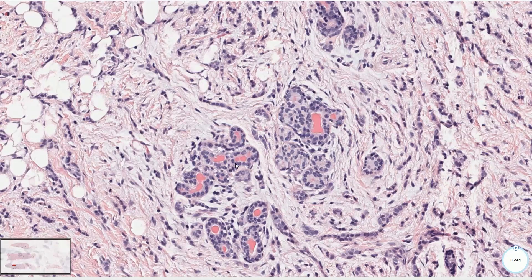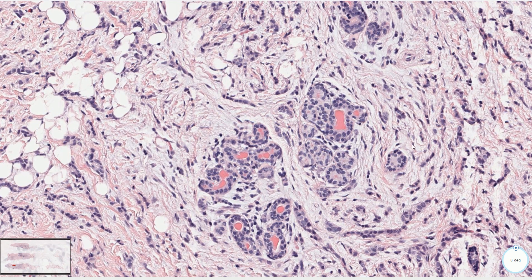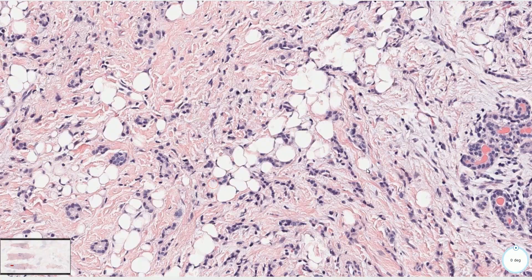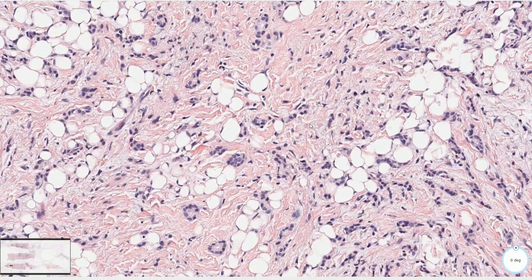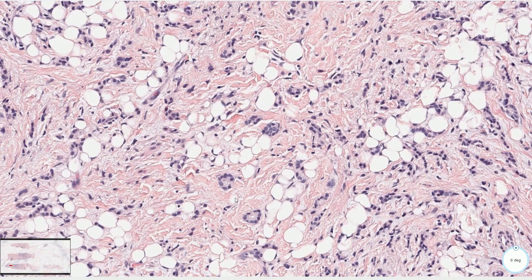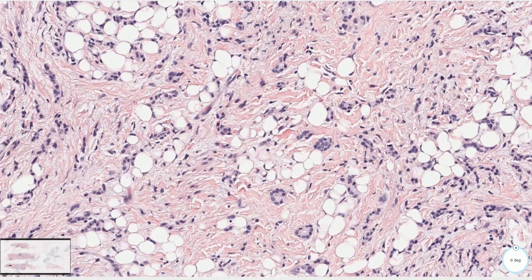Here is another nest of tubules, and here we have another small two tubules with round lumina. This carcinoma is low-grade and well-differentiated.